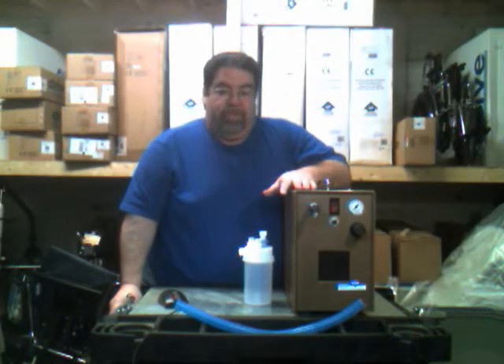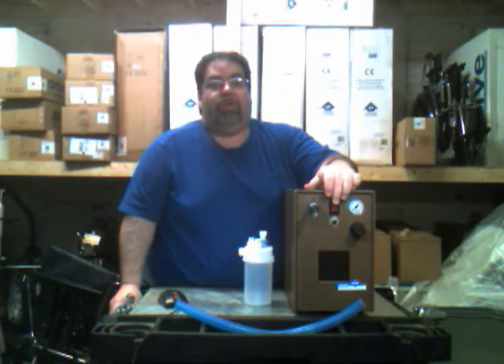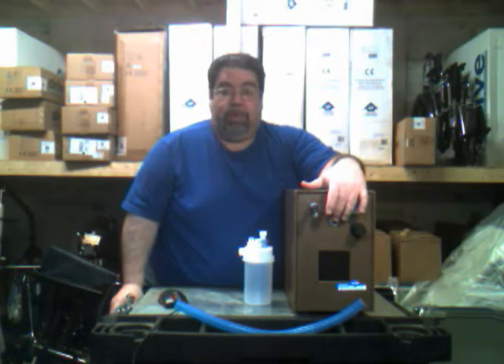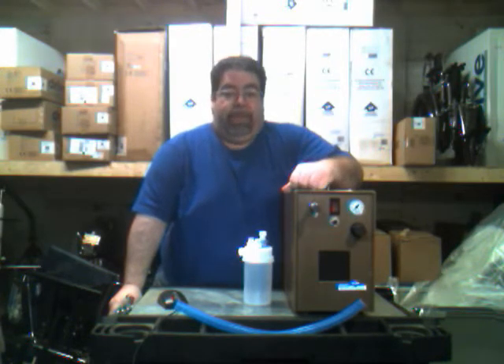Let's go over some of the features on the front panel. First, we're going to start with the red button, which is the on/off button — works just like a light switch. Under that button you will see another button, which is a reset button. This is used in case the machine happens to turn off for no reason. You just hit the reset button, push it in, and the machine should start right back up again.